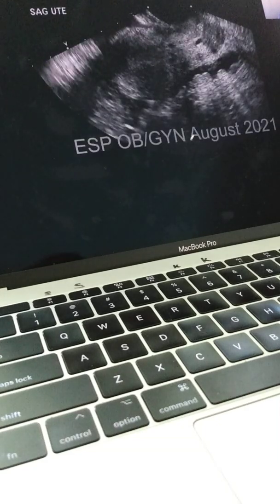Transvaginal sonography is sensitive to smaller amounts of fluid, so we can see a small amount of fluid in the posterior cul-de-sac. What are we looking at with these? Raise your hand if you think that that is free fluid in the anterior cul-de-sac.